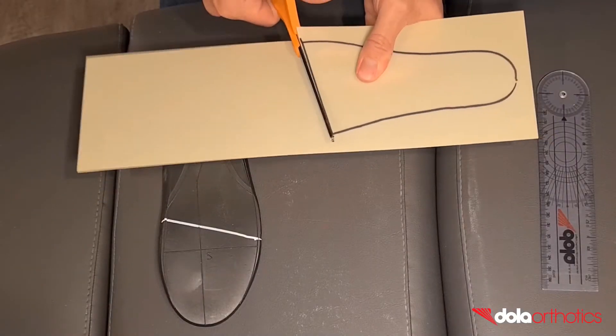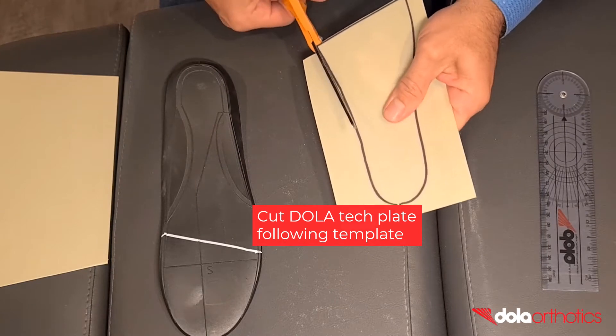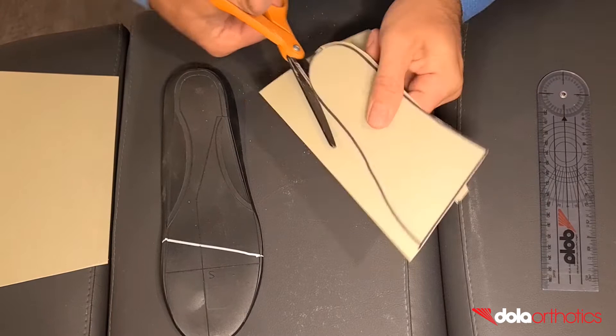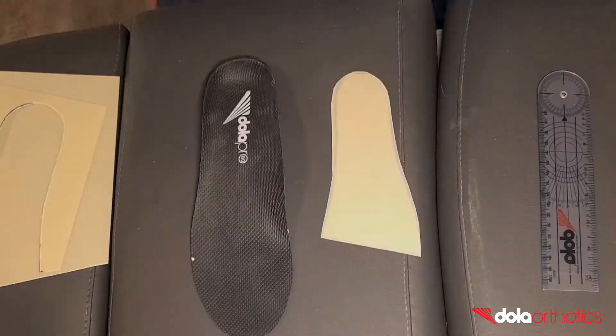Remove the orthotic and connect the medial and lateral marks with a line to match the shape of the gait plate. Using scissors, cut the Dollar Tech plate following the template markings. At 0.8mm thick, the Dollar Tech sheet is easily cut in-clinic and is available in 40cm x 12cm pieces to fit the entire Dollar Pro size range.